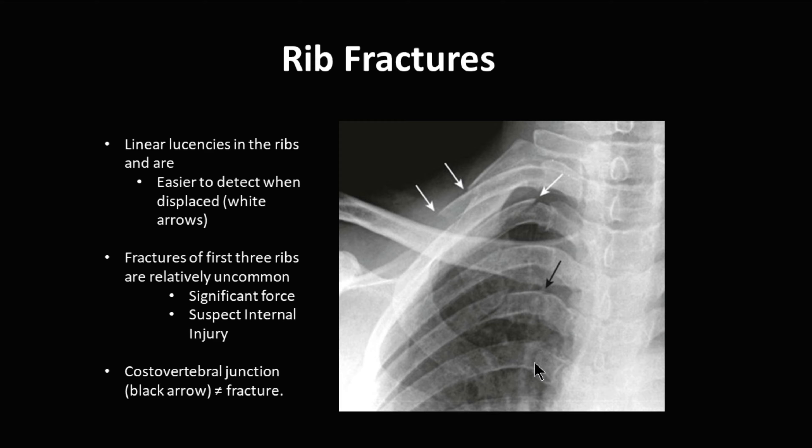Some folks look at the costovertebral junction and think this must be a fracture. This is actually anatomically correct — this is the cartilage, and this is the bone. This lucency right here is actually the junction between that cartilage and the bone.